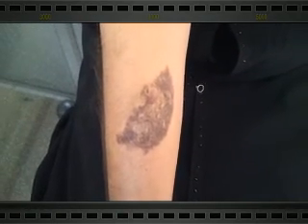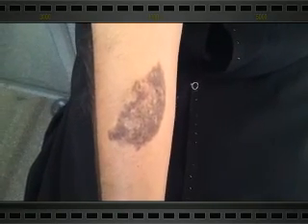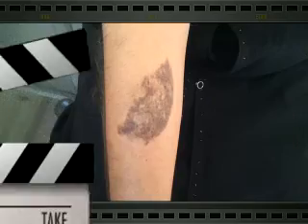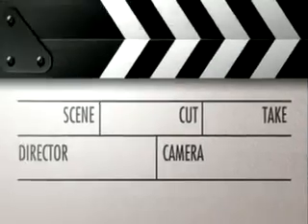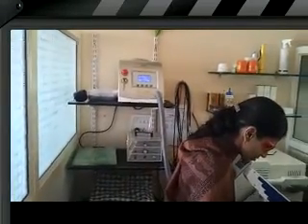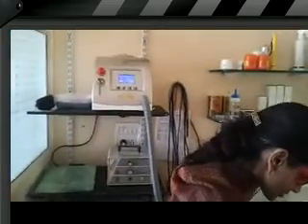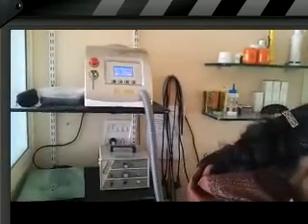Now we are going to do the third sitting of YAG laser. This is the RY280 laser. We are going to do the YAG laser treatment of the Becker's nevus.